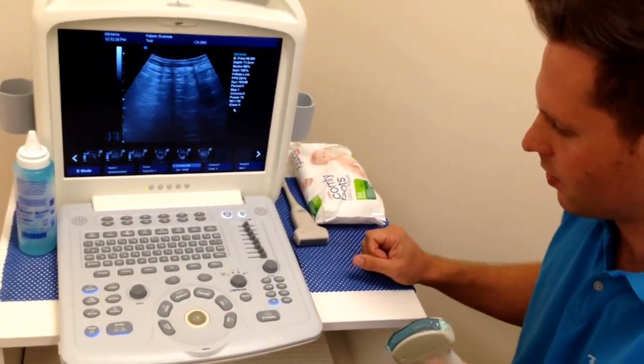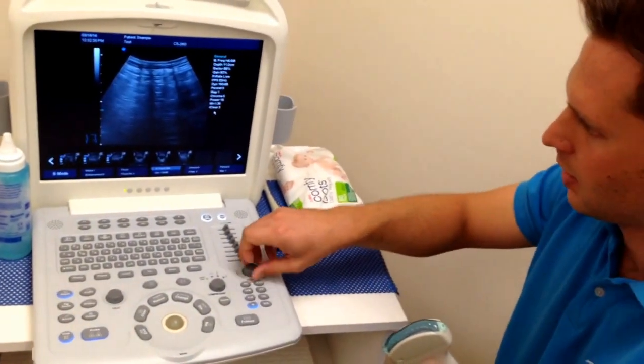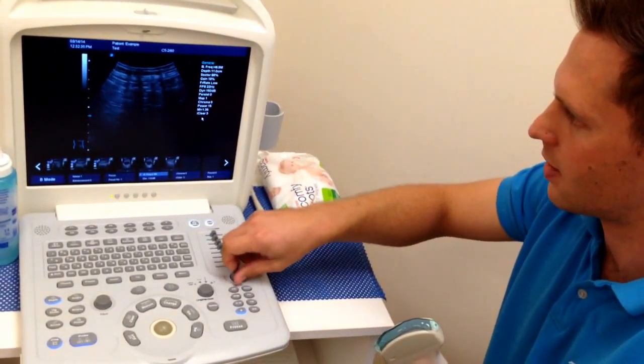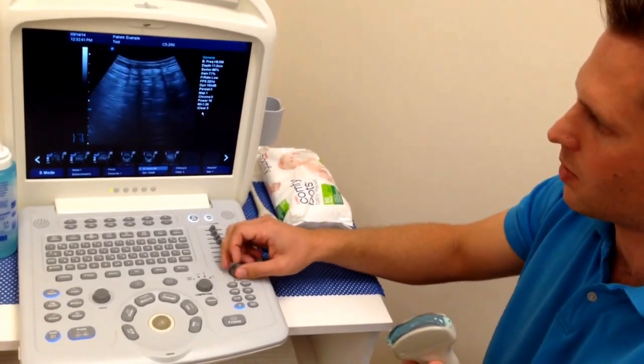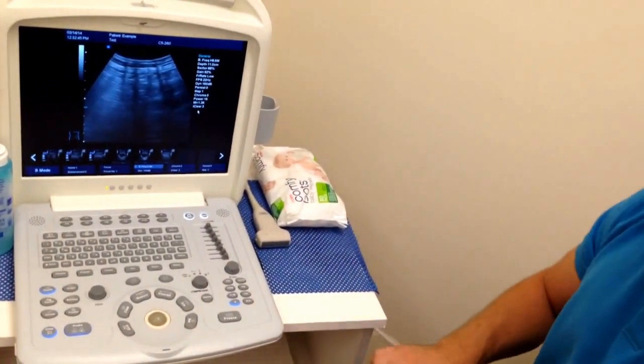Apart from that, we have the gain function. Gain is going to give us our brightness. So if we turn our gain right down, we start to notice that the picture becomes less bright and disappears, and we can turn it back up as well. We're just going to adjust the gain — if I put this on the muscle here, it'll give you a little bit of an indication.